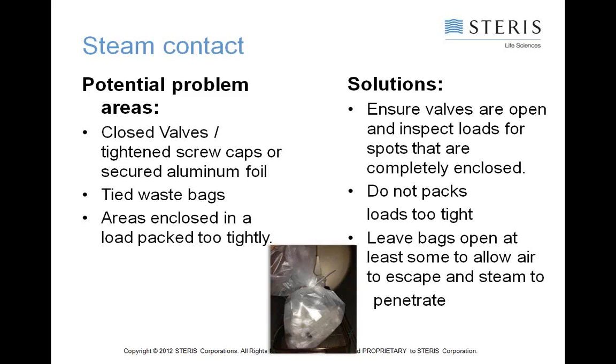The other thing about packed loads is it leads to an inefficiency. We want to be efficient, so we pack it tight. But at the same time, the denser the load, the more the steam's broken down and condenses, and of course, then the longer we have to continue to eject steam to bring things up to temperature.